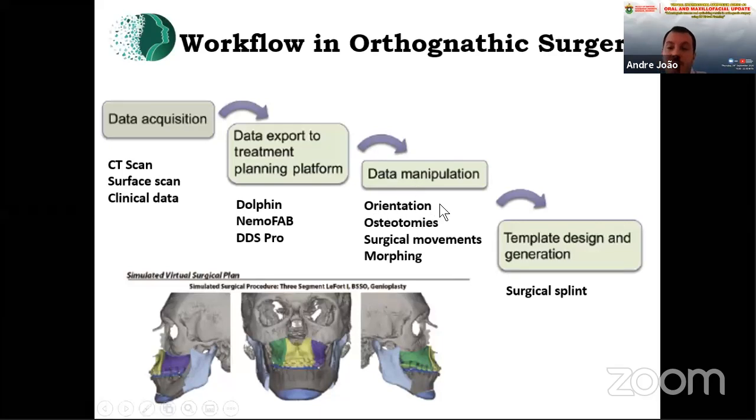So some steps are really, really important. Orientation: place the CT scan in a position that translates the position the patient is in in real life.